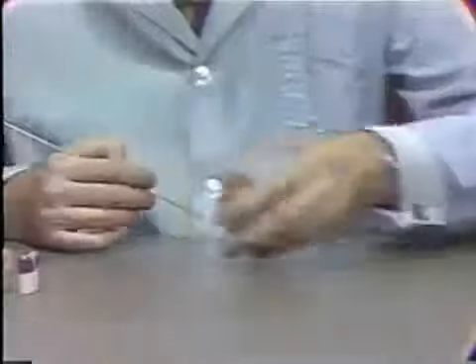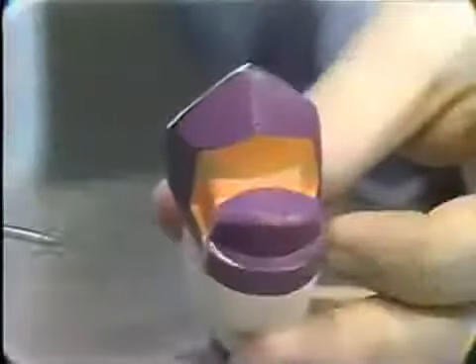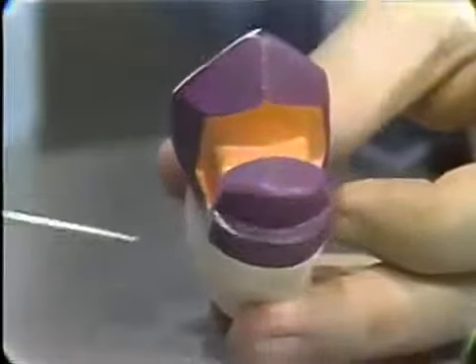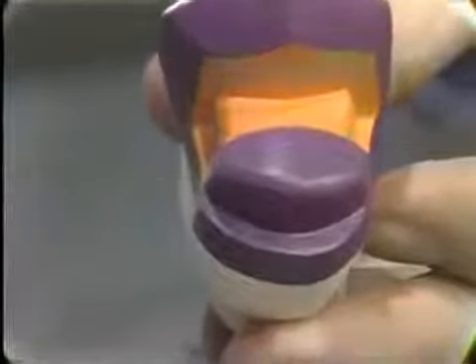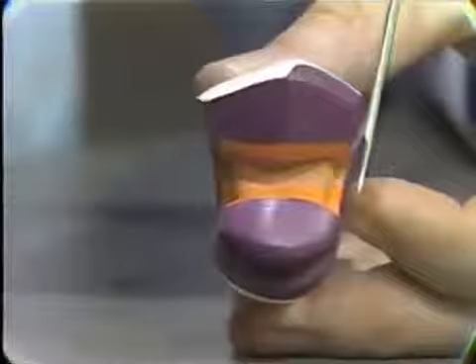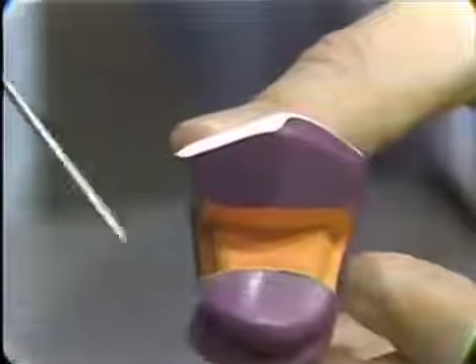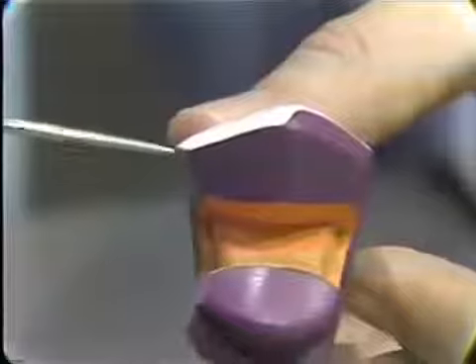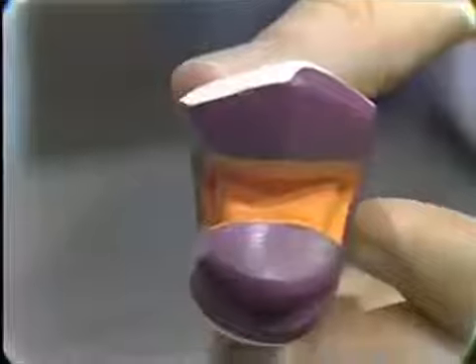Here is another variation of the same type of preparation in which a ledge is cut around the lingual cusp in this situation, just to give added retention and added protection to that particular situation. But the rest of this preparation is essentially the same as the previous one. You can see the combination of the slice on the distal surface here, of the greater occlusal protection of the distal slope of the buccal cusp, and then on the mesial surface here the use of the box type of preparation to reduce the extension into the proximal area there and reduce the amount of gold which is exposed.